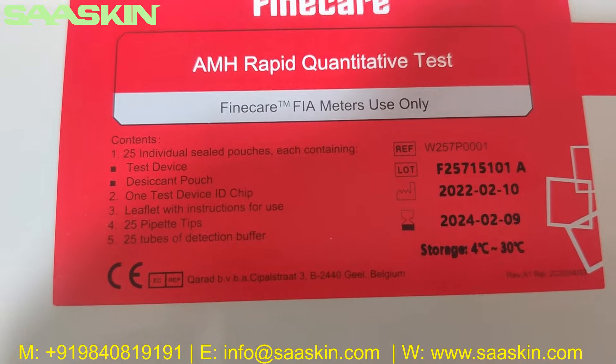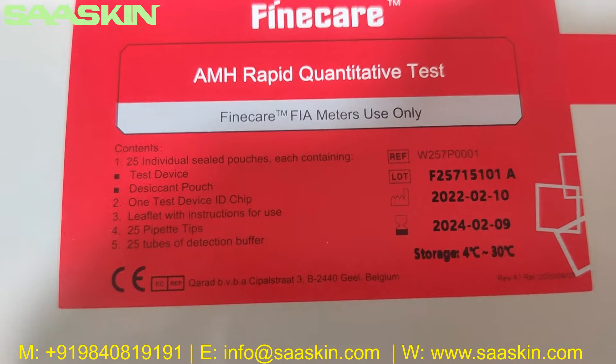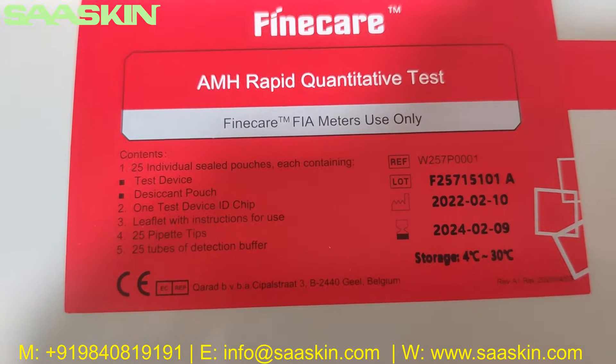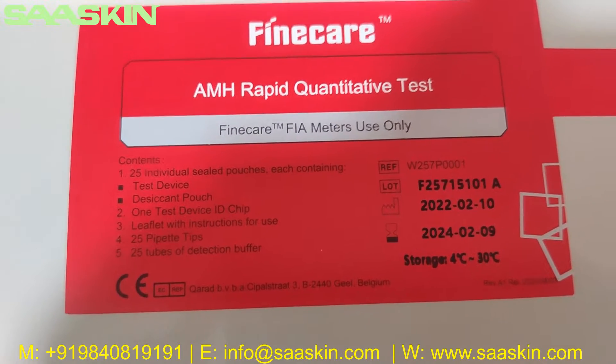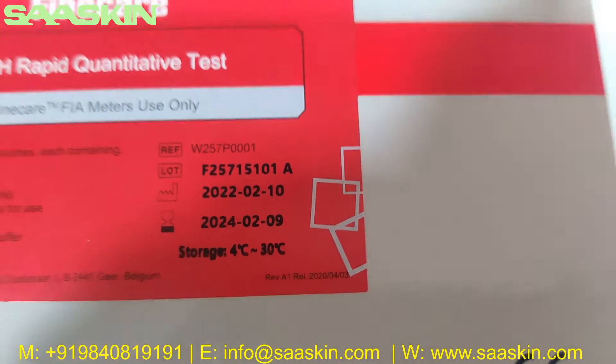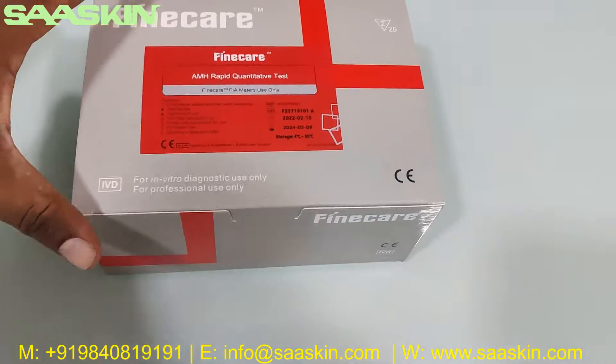Inside you get 25 test cartridges, one test device ID chip, and the instructions for use. There are also 25 paper tips and 25 detection buffers. You can see the lot reference part number, lot number, manufacturing and expiry date, and storage temperature range. Let me just show you around the box.